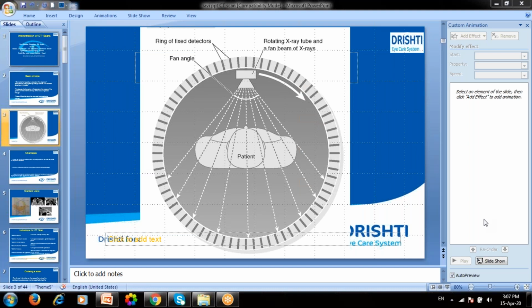When should we perform dynamic imaging while performing this scan? About dynamic, sir? Again, I'm not able to understand your question. Yes, sir. When to perform dynamic imaging? Okay, dynamic imaging.